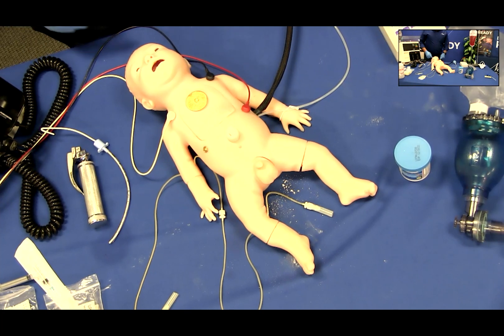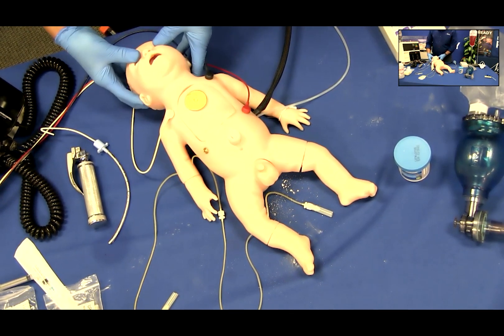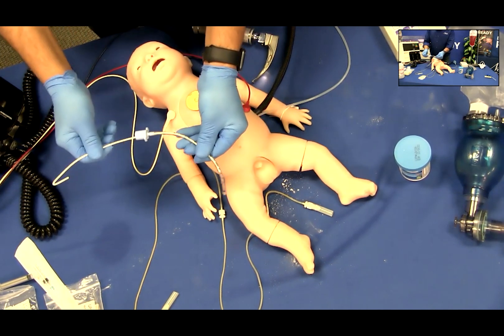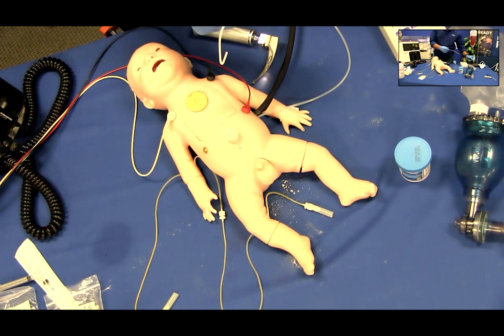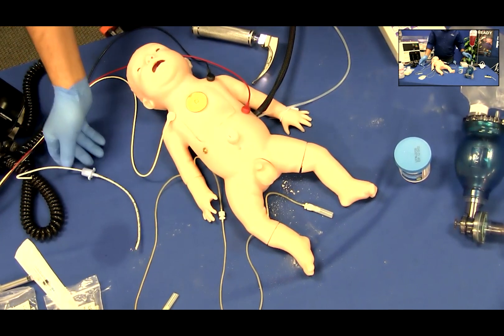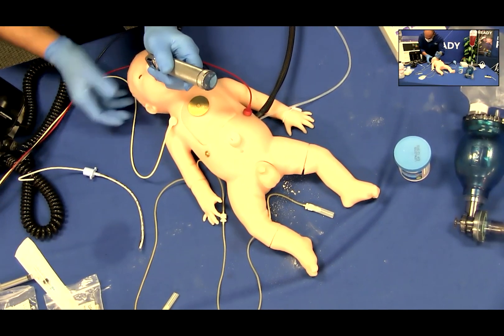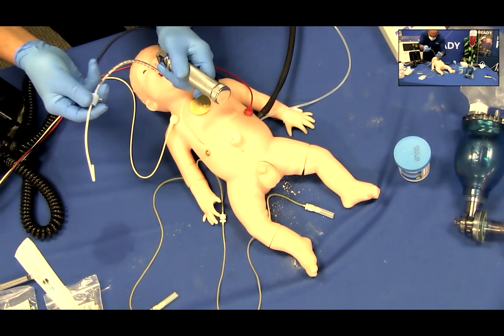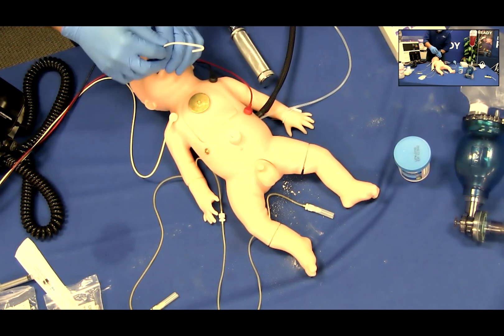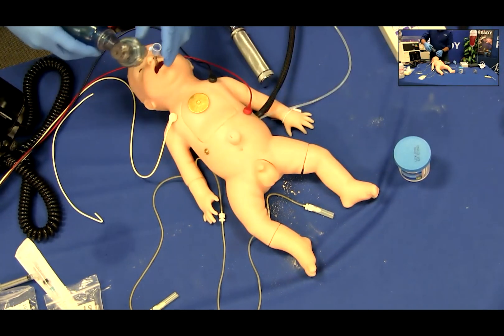Intubation. Charlie allows for normal intubation and advanced or difficult intubation skills to be practiced. A number 1 blade and a standard 3.5 mm ET tube or number 1 LMA is needed to practice airway management skills. Always be sure to generously lubricate the recommended equipment with the lubricant provided. Gently slide the blade into the mouth, depressing the tongue to view the airway. Insert the ET tube or laryngeal mask airway following general practice guidelines, then ventilate the infant airway simulator using a bag valve mask.